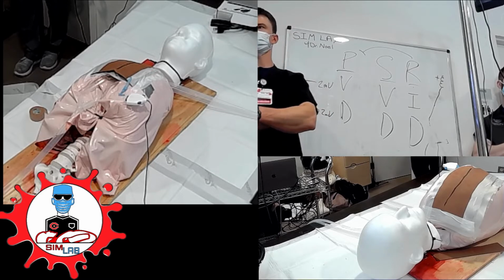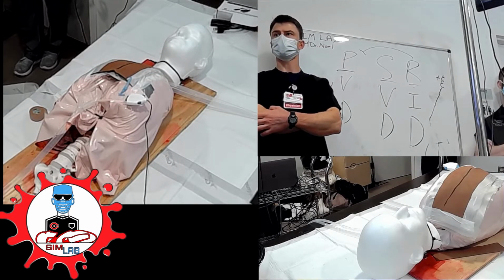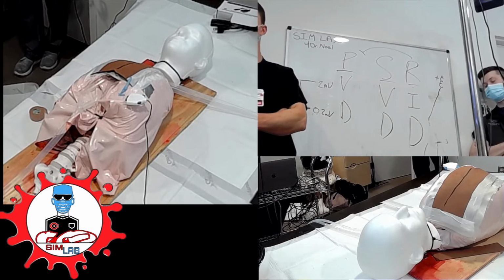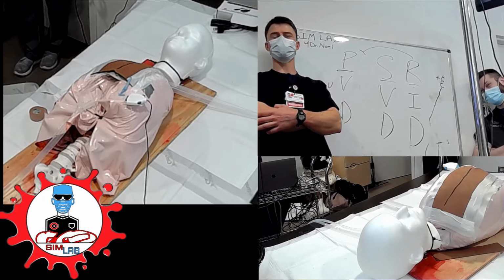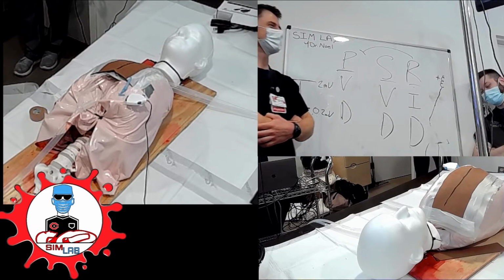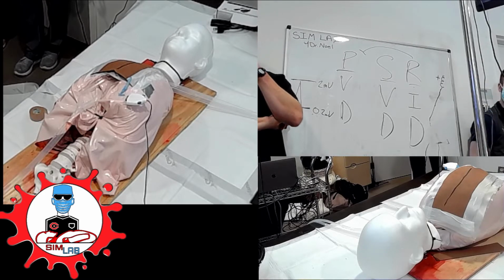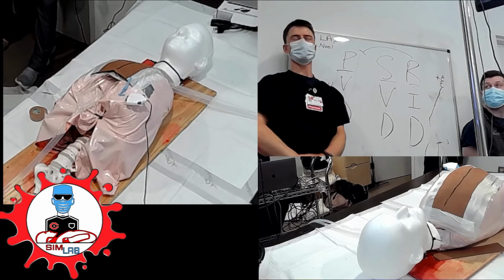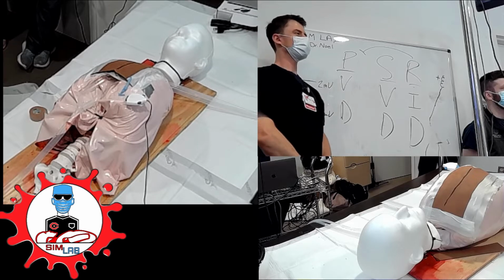I remember we had one patient we had laying on her side with a new ground, telling her not to take deep breaths, to just maintain capture until the morning, until she was able to get her permanent pacer. So would you try going then? Again, you can't wire it across the tricuspid, so it's tricky.